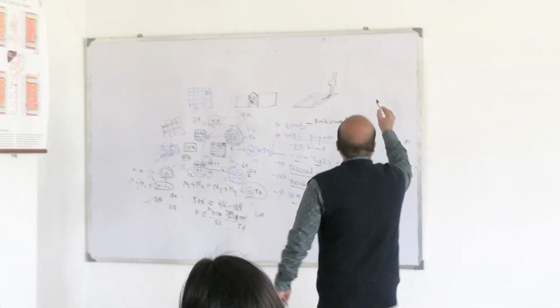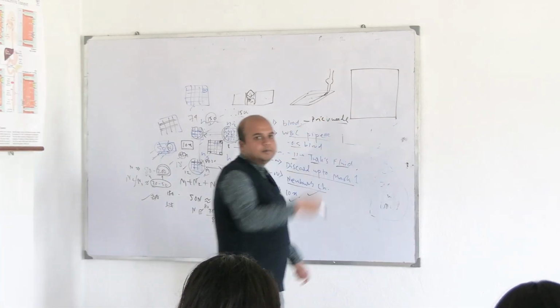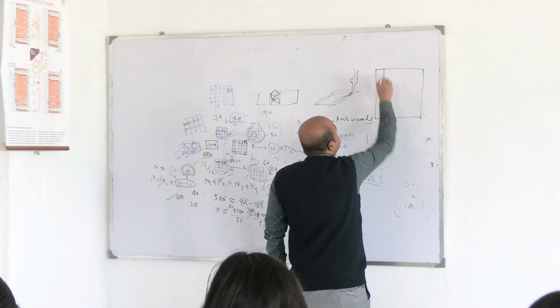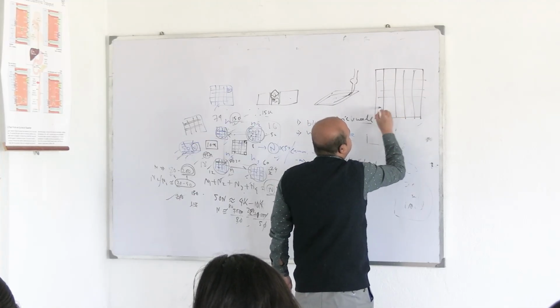So in case of RBCs, we use the central square of the whole improved Neubauer chamber, 3 mm into 3 mm. So again it's 1 mm into 1 mm, and this is divided into, just to revise the calculation once, 25 equal squares.